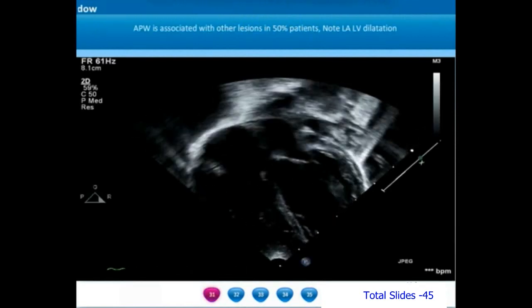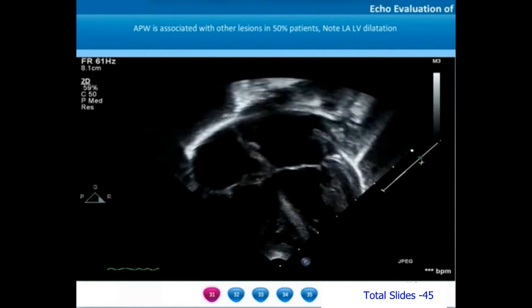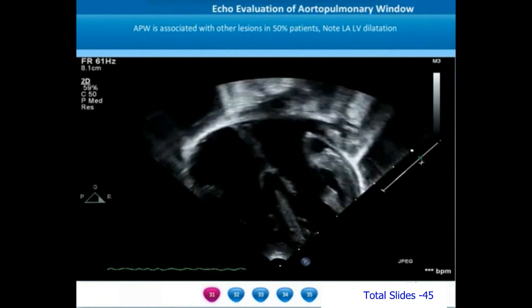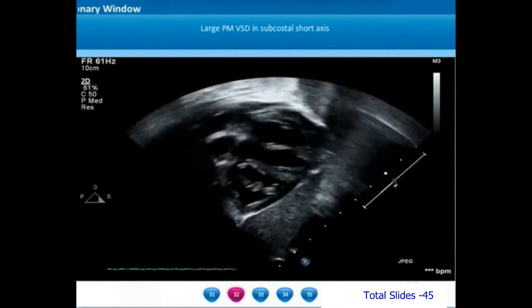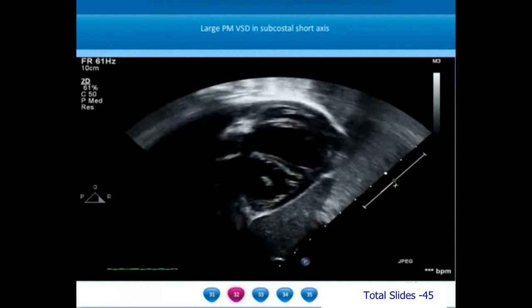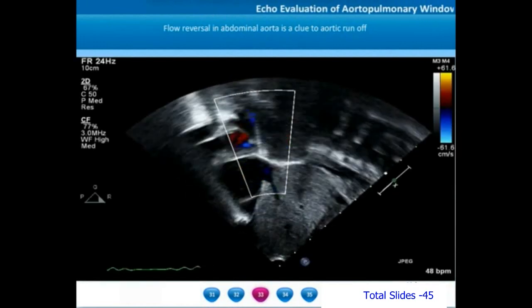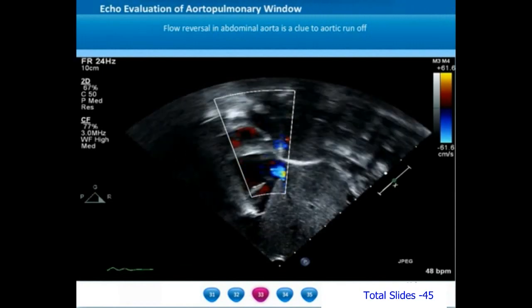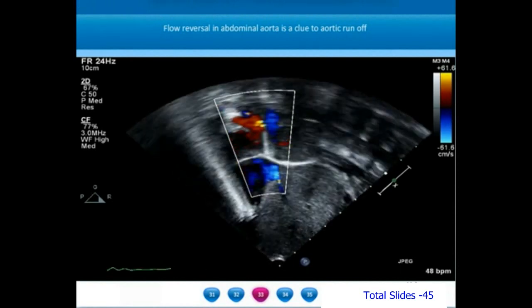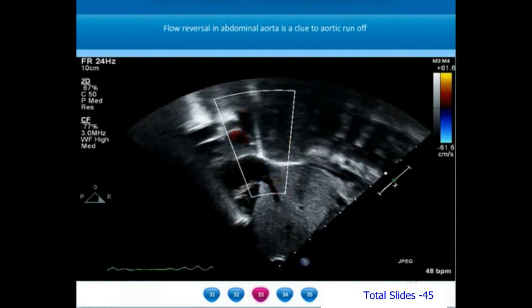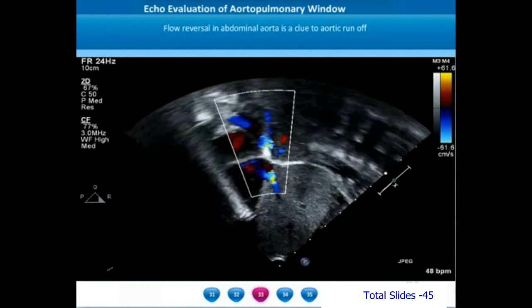Aortopulmonary windows are often associated with other lesions in almost 50% of patients. In this apical view, we notice a left atrial and left ventricular dilatation indicative of a possible post-tricuspid left-to-right shunt. On a subcostal short axis view, we notice a large perimembranous ventricular septal defect, explaining the chamber enlargement. When we look at the flows in the descending thoracic aorta from the subcostal window, we notice a blue color flow in diastole — this flow reversal in the descending thoracic and abdominal aorta is a clue to aortic runoff.